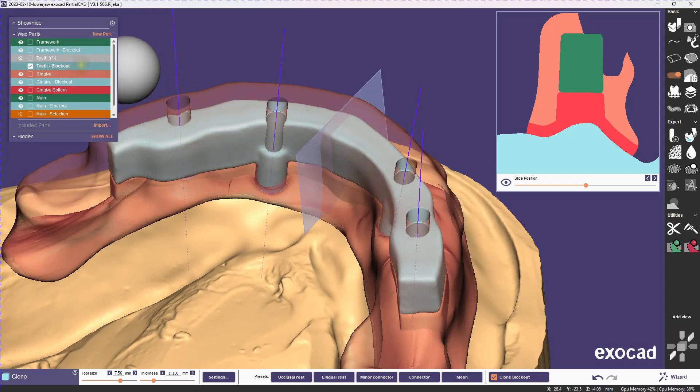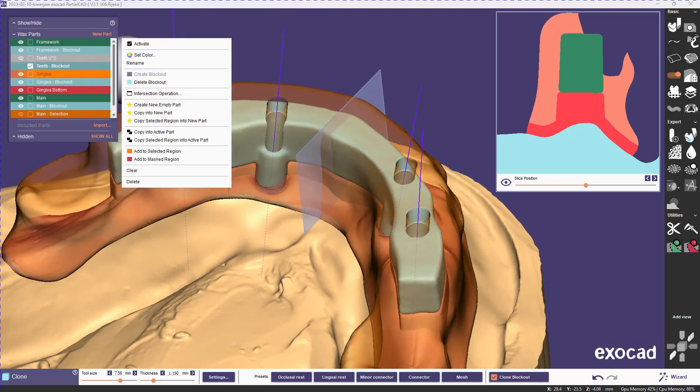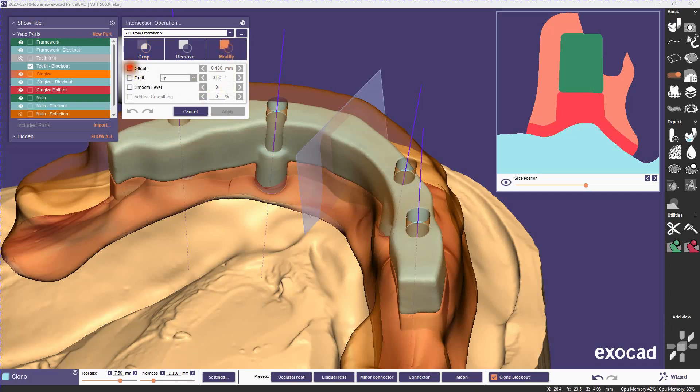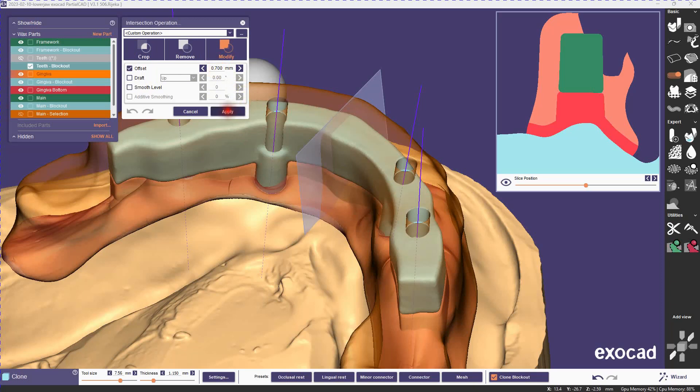So I have my block out now in my tooth volume, and now within the gingiva, I'm going to expand it. We'll give it a thickness of somewhere about 0.7 millimeters or so. Whatever you want the minimum thickness of your gingiva to be.